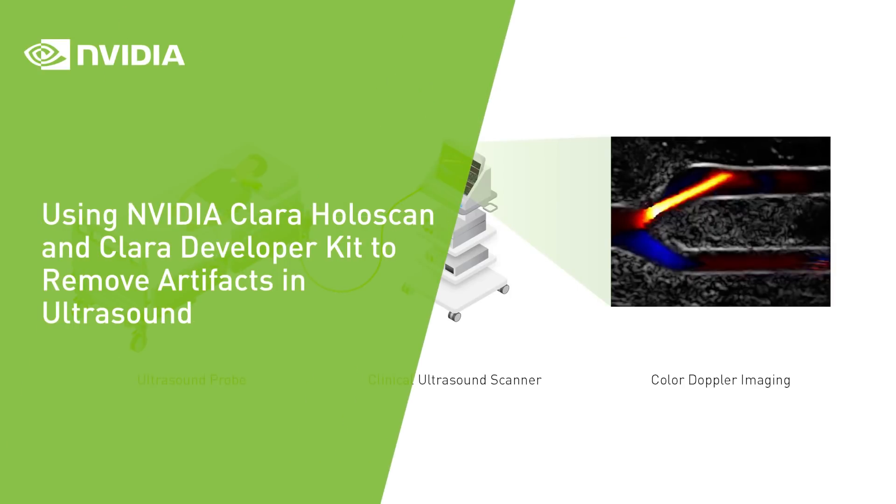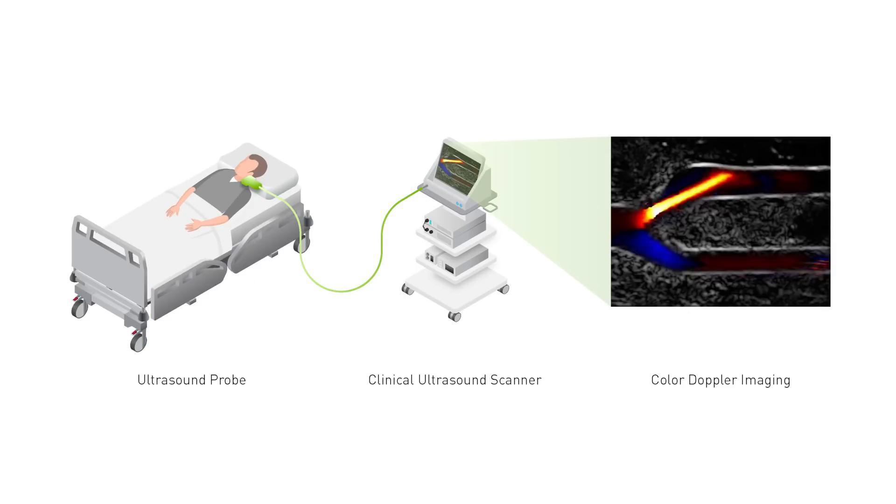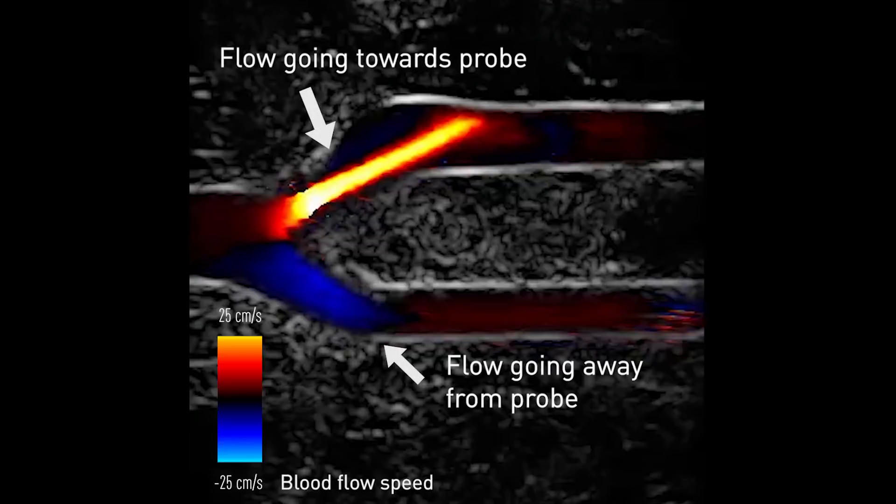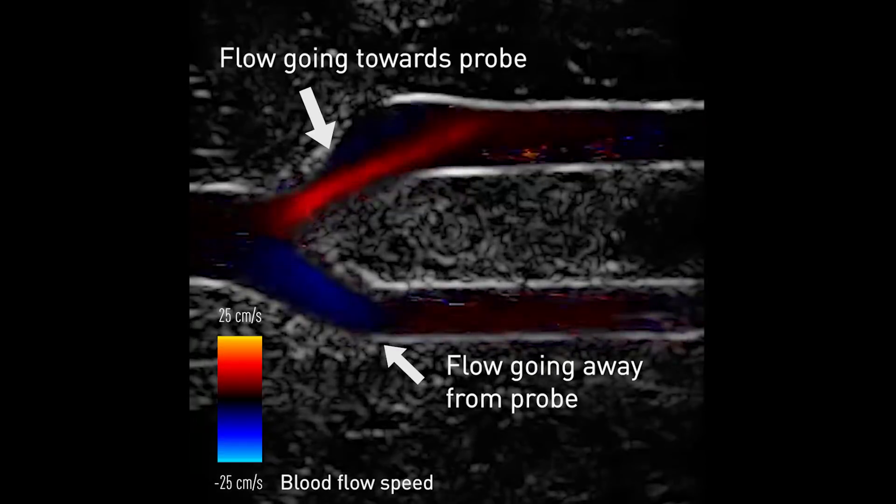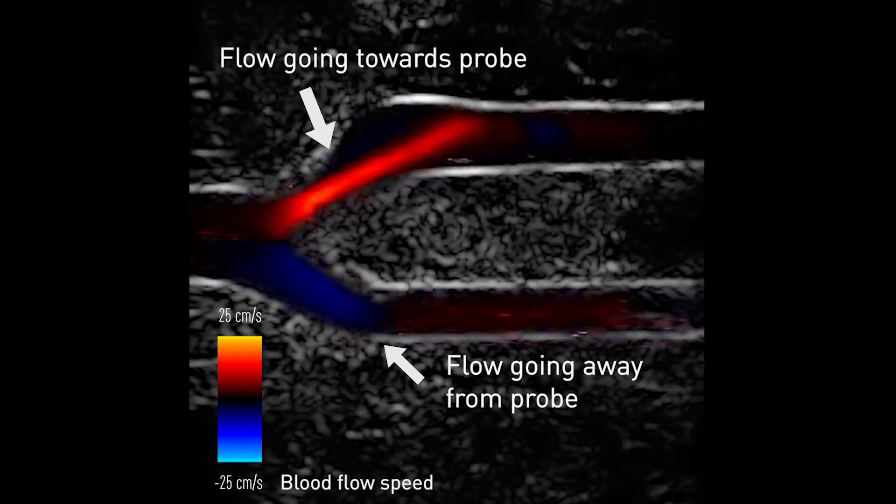Color Doppler Imaging or CDI is widely used in ultrasound imaging to visualize blood flow in arteries. This is a typical CDI sequence from a branching artery. Shades of red indicate blood flowing towards the ultrasound probe and shades of blue are used for blood flowing in the opposite direction.